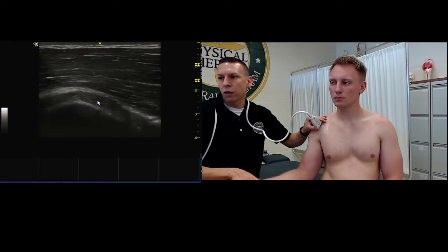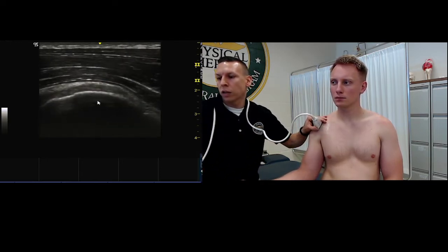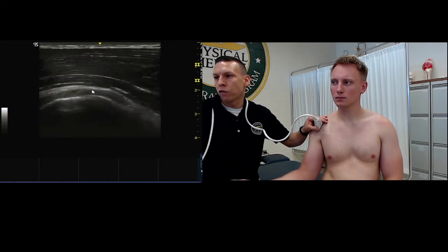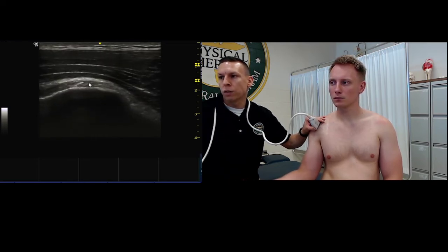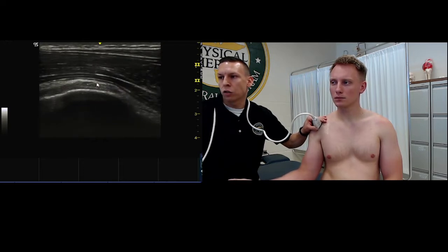And from here, this rotator cuff muscle or tendon actually has an interesting appearance, because the different muscle fibers have bundles, and it looks like bundles of tendons. So don't mistake that for intrasubstance tears or anything. That's just the normal appearance of the subscapularis in short axis.